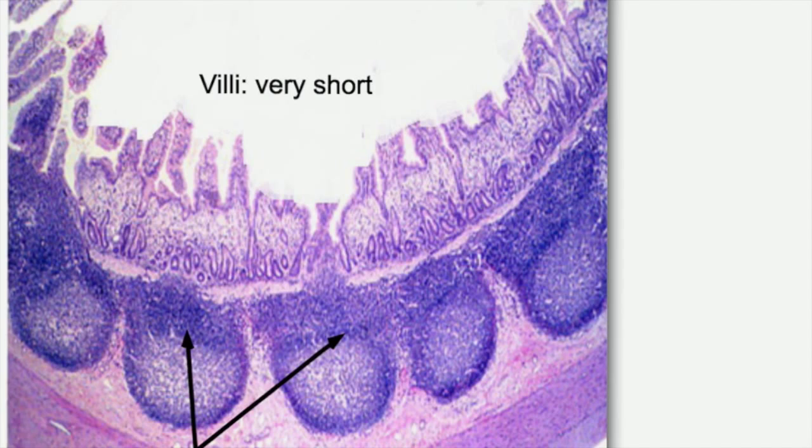This is a very nice picture for the ileum at the region of the Peyer's patches. Here we have the Peyer's patches, which are lymphatic nodules, originating in the connective tissue mucosa and piercing the muscularis mucosa to appear in the submucosa. And this is the rest of the submucosa, the inner circular, outer longitudinal, and this is the lumen.